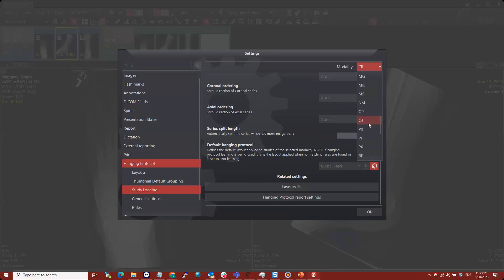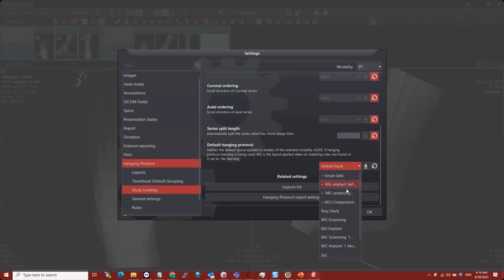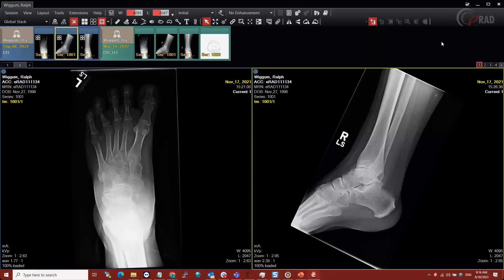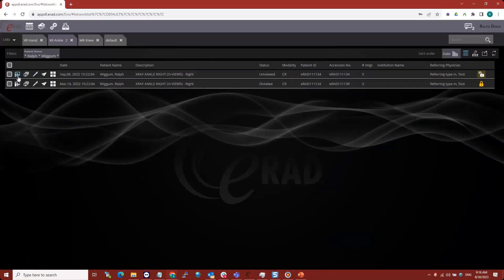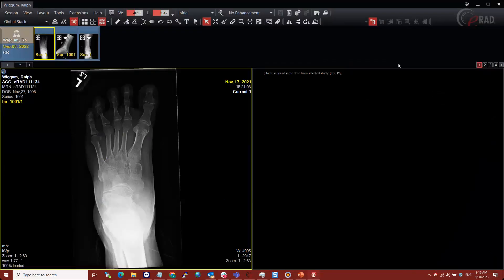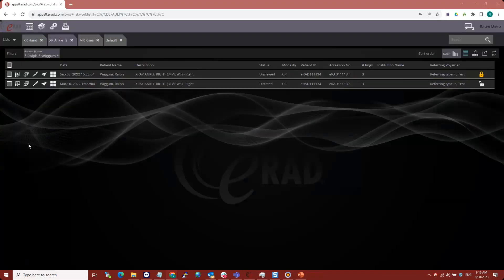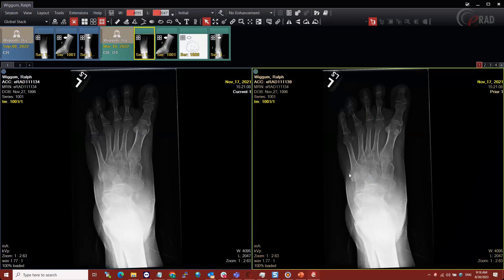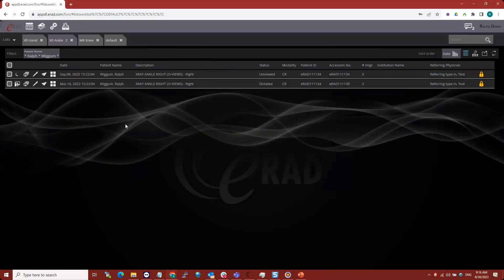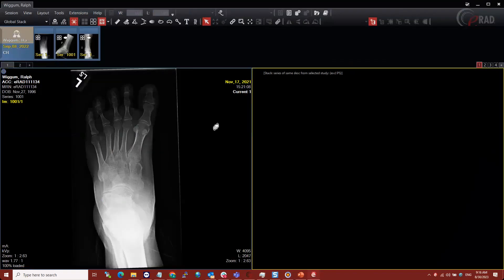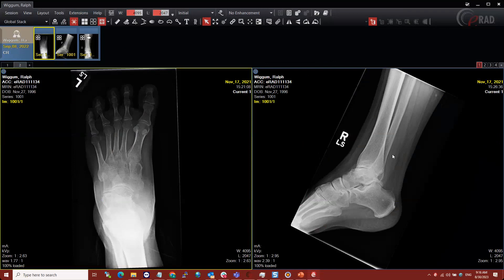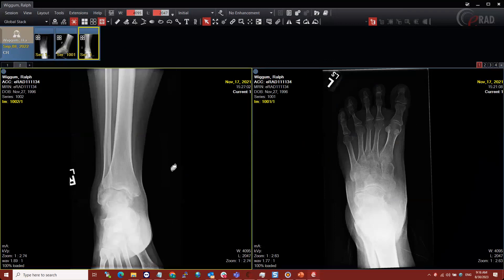Now if I close and reopen the study, I've got my Global Stack. This one doesn't have a prior, so the second page is empty. But if I open it with a prior, it's there — I can go to page two and see the prior stack. For x-rays, this is nice because if page two is empty, it tells you there's no prior. I can scroll through either frame and line them up however I like — my PA and lateral chest, or two different views side by side.